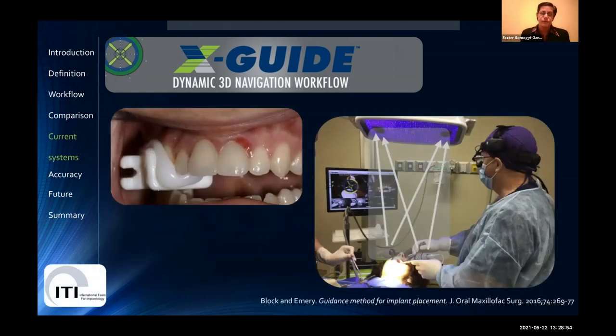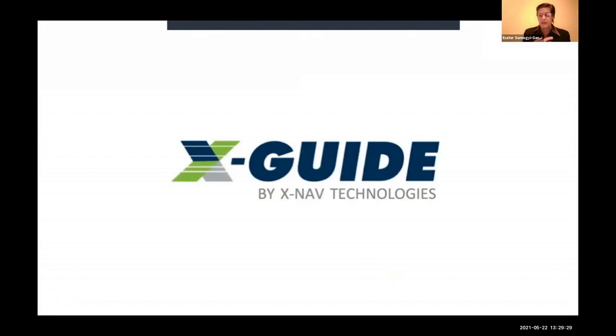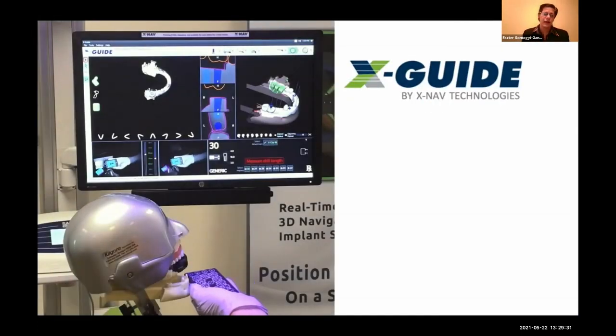And if all goes well, I have a little video to show you how it's approximately done. And this is just that little intraoral marker that is going to hold the fiducial markers. And you can see that the surgeon's position is actually different because the surgeon is looking at the screen instead of looking at the patient, which is very difficult because you have to trust the system. But with this paradigm shift, one eventually learns and trusts the system and doesn't look at the patient while doing surgery in their mouth. It's a bit scary in the beginning, but one can get it. So this is their video, and you can see how it actually works.